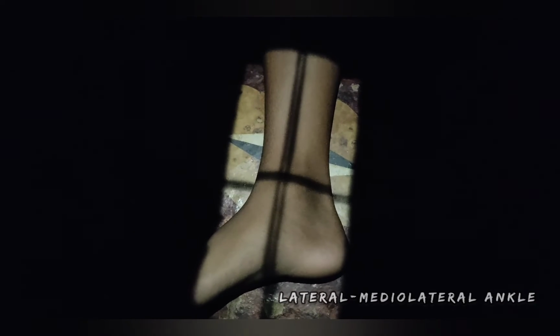Lateral mediolateral projection ankle. Patient position, patient in the lateral recumbent position, affected side down, then flex knee of affected limb about 45 degree. So, part position, leg and foot in true lateral position. So, CR is perpendicular to IR directed to medial malleolus.